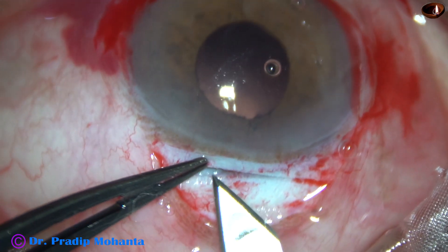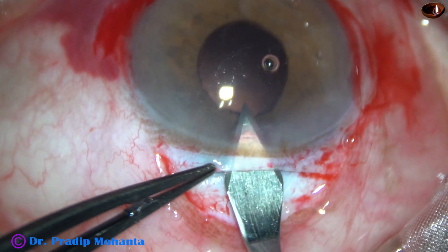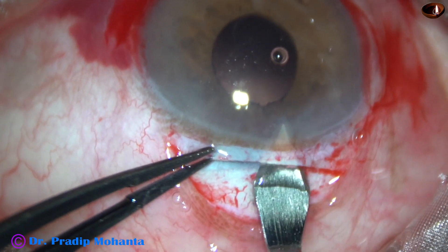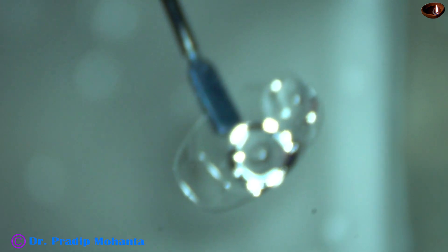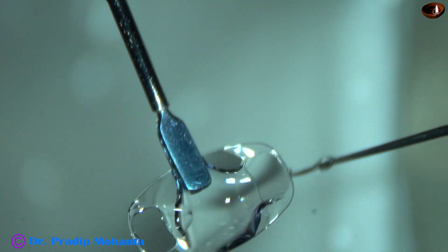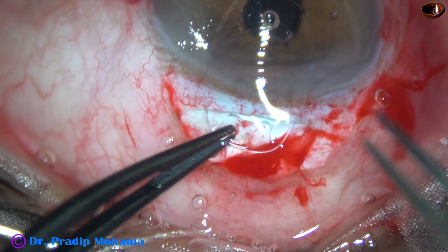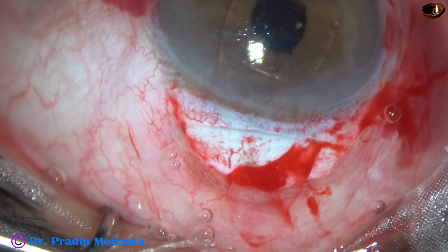And now the sclerocorneal tunnel is opened. By this time, the assistant is ready with the lens. The tunnel is completed, and this is the lens. This is examining the gap in the haptic for enclavation, and here goes the lens into the anterior chamber. It has to go this way, then you just rotate the lens and place it horizontally.